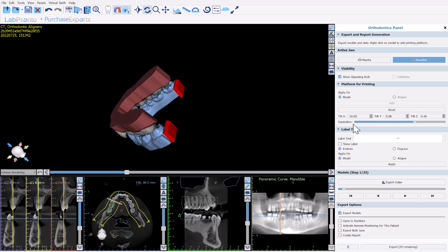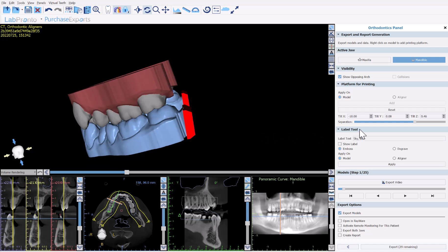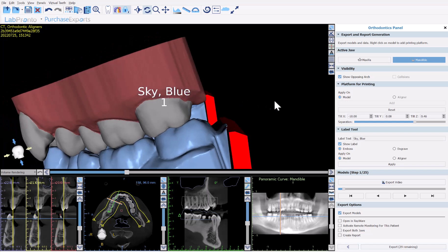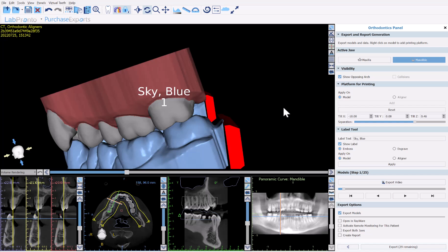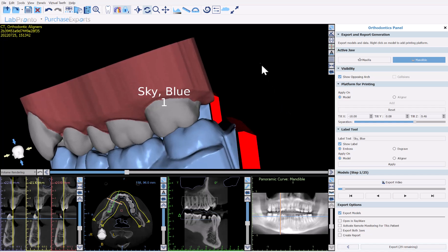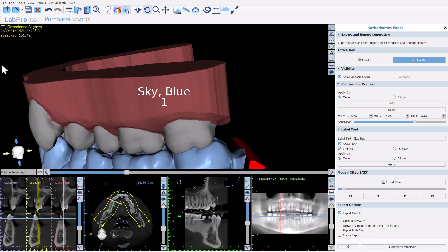Next is the labeling tool, which enables us to emboss or engrave text along with the model number directly onto the model and/or the liners. If you've designed aligners in Blue Sky Plan and are exporting the STL of the liners for direct aligner printing, you can emboss or engrave on the model or liner. If exporting only the models, the emboss or engrave options will only apply to the model itself.